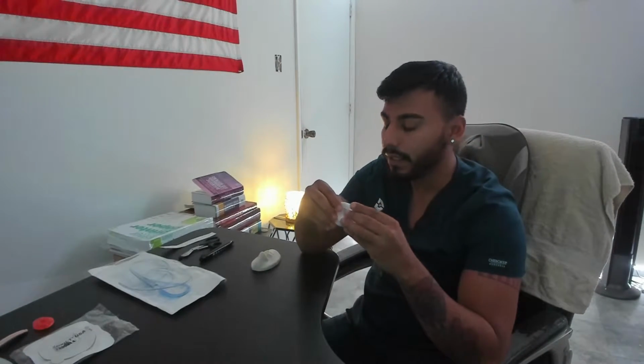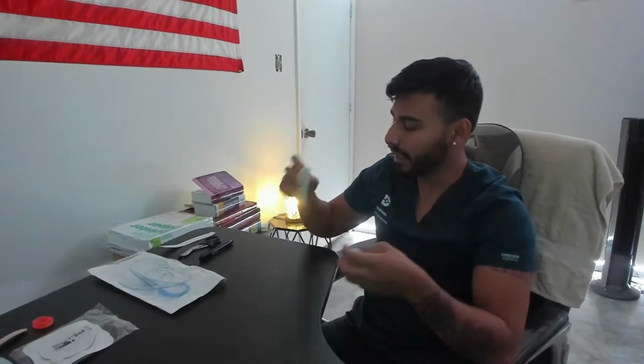And a quick consideration with the tape that was in one of my bags. While I was practicing, it doesn't really stick well with the simulation nose, but I'm going to do the best I can. It works okay. I'll say that it works okay.